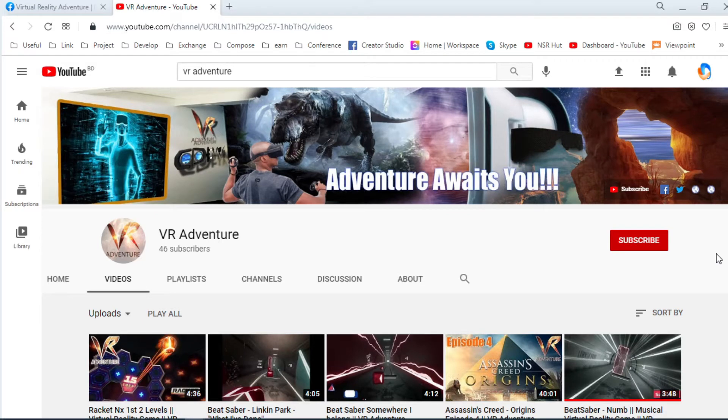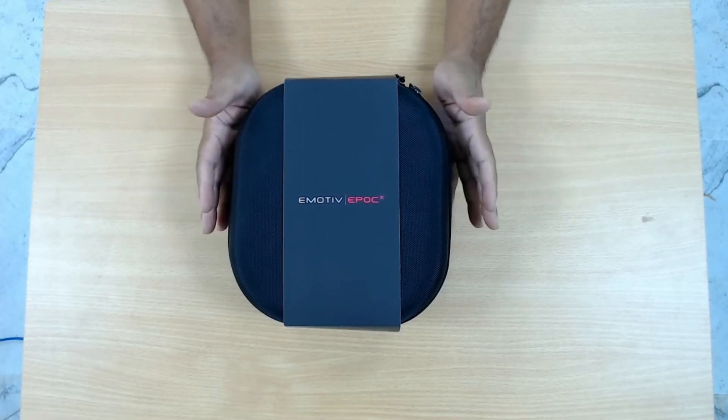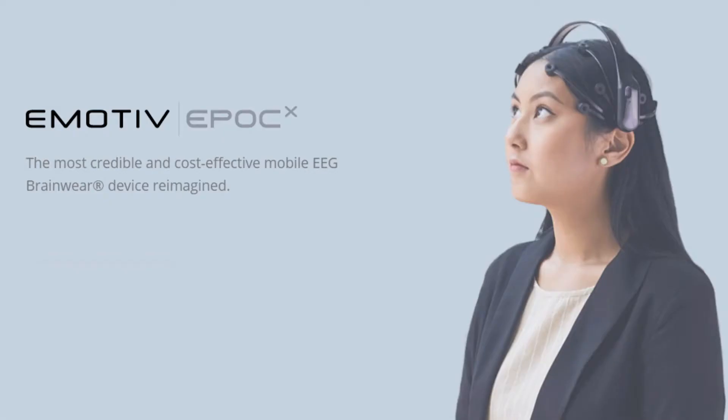Hello everyone, welcome to Virtual Reality Adventure. Today we are very excited to unbox something very research related — that is this box. It is named Emotiv Epoch X.